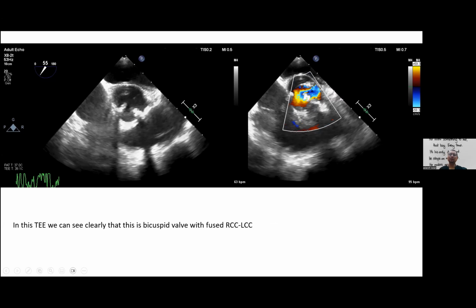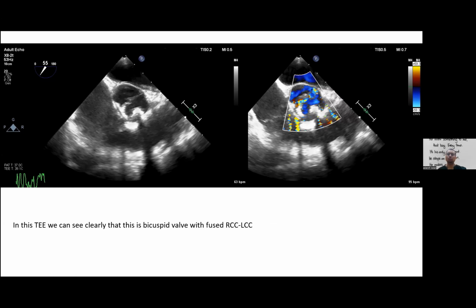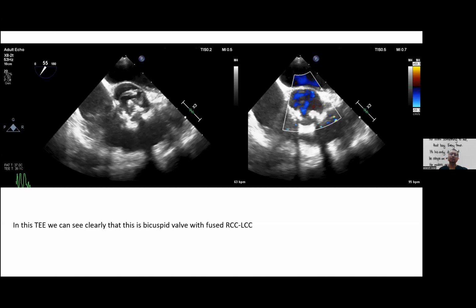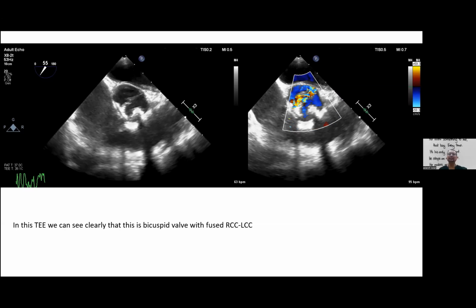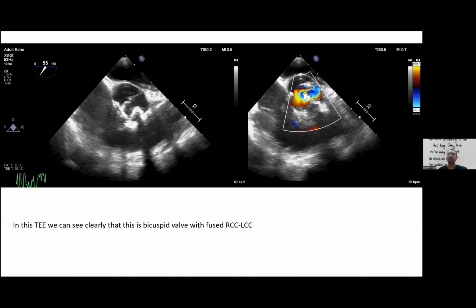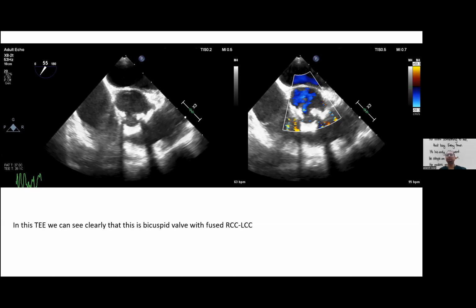A less well-known fact is that one of the main reasons for reverse area gradient mismatch is bicuspid aortic valve. Why? Because in bicuspid aortic valve with aortic stenosis, sometimes the turbulent flow rather than central is eccentric. This eccentricity hits the aortic wall very near the aortic root, and causes a higher gradient for a given aortic valve area.